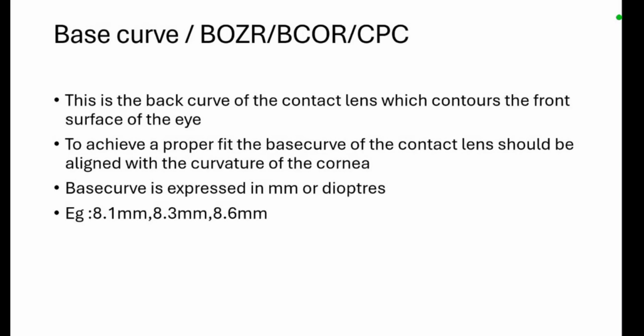The base curve is expressed in mm or diopters. For example, 8.1 mm, 8.3 mm, 8.6 mm. In diopters, 44 diopter, like that, 41 diopter. In diopter also it is expressed.